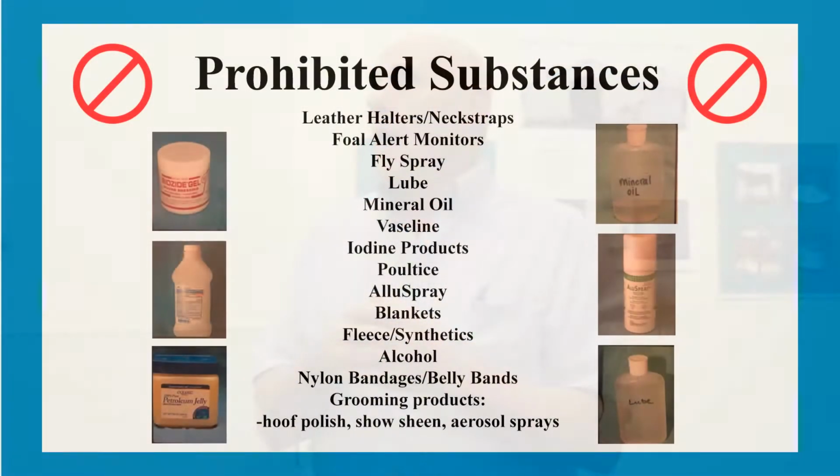Any perfumes, if you come in smelling like you just put perfume on, you're going to have to wash it off. Anything that is a volatile gas, which could act as an accelerant, like alcohol in your aftershave, can't go in the chamber. So the same thing with horses. We don't allow absorbine or alcohol rubs or leg braces. None of that is allowed in the chamber.